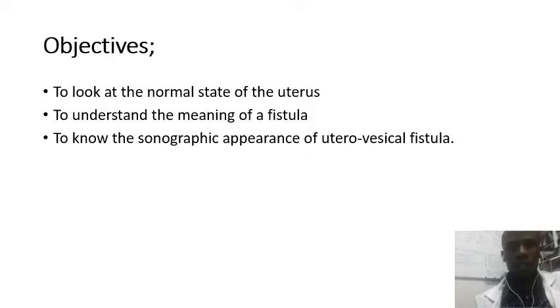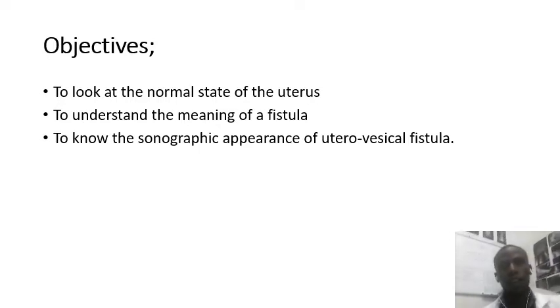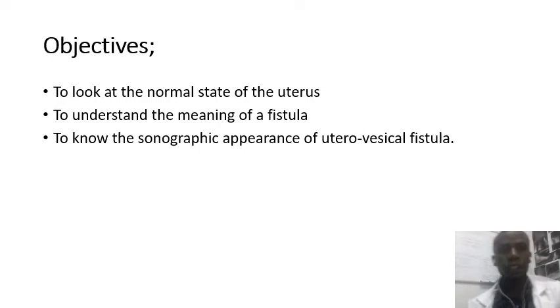We are going to be guided by the following objectives. Number one, what does a normal uterus look like, more so on ultrasound. Then number two, what is the meaning of the word fistula? And lastly, what is the sonographic appearance of utero-vesical fistula?